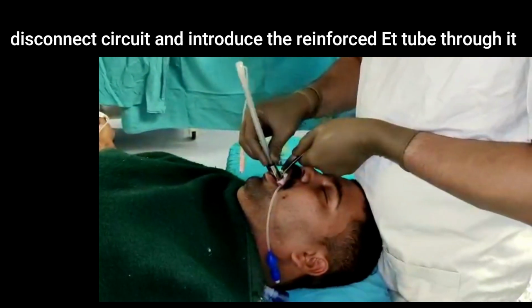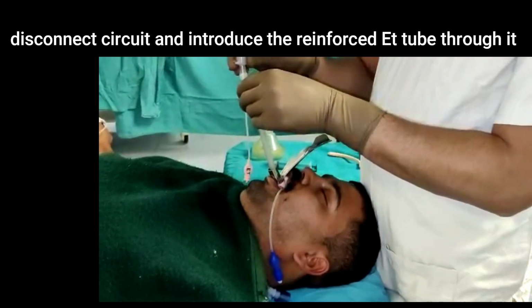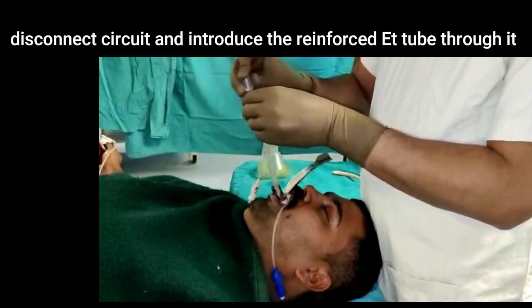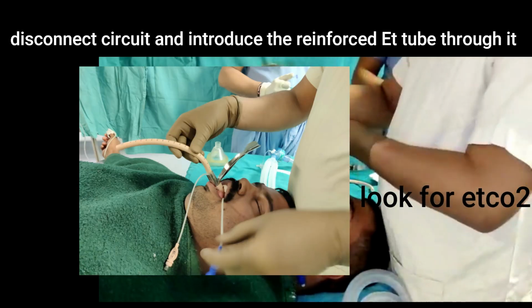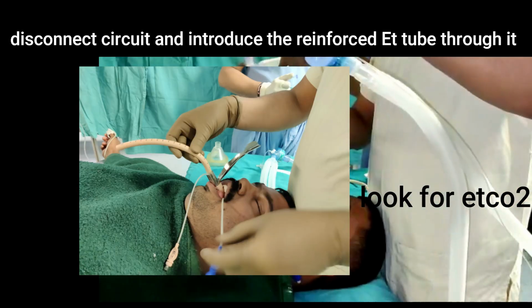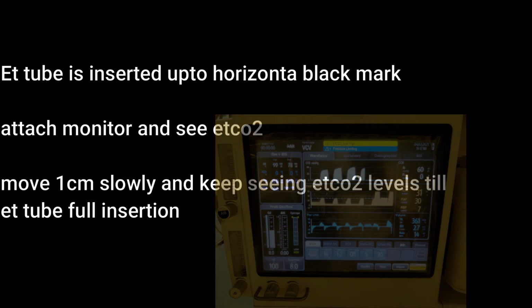After that, move the ET tube slowly and keep watching the ETCO2 levels till the ET tube's full length is inserted. After this, attach the insertion rod to remove the ILMA while keeping the ET tube inside. Inflate the cuff and connect the circuit. Confirm by ETCO2.